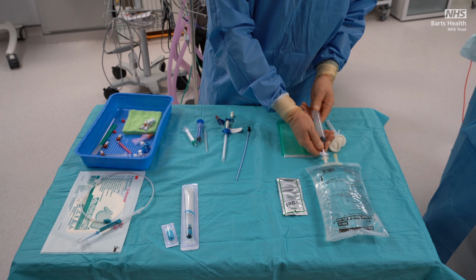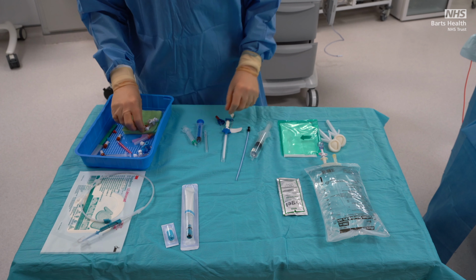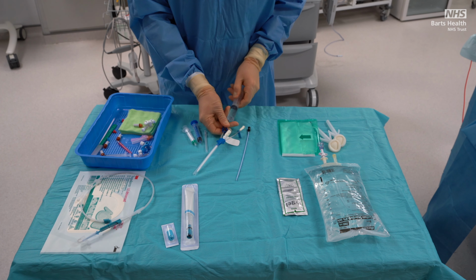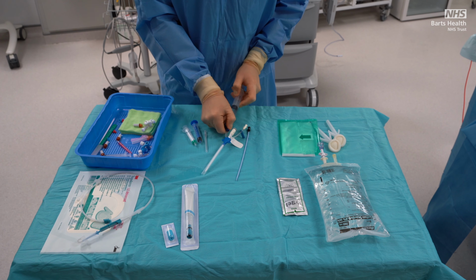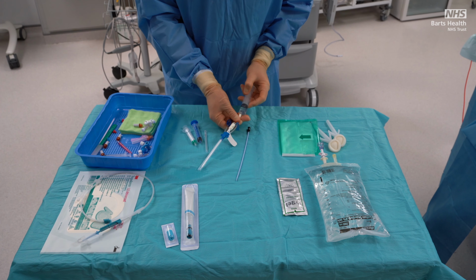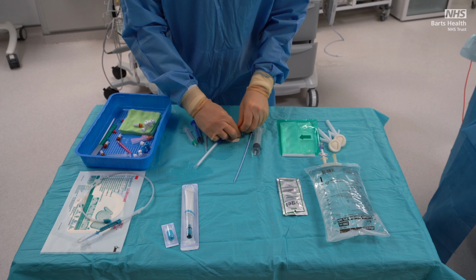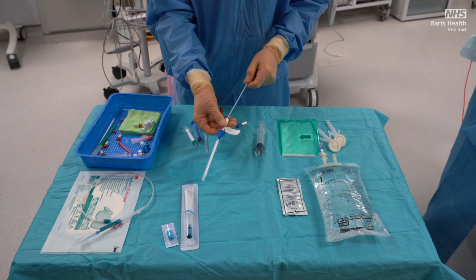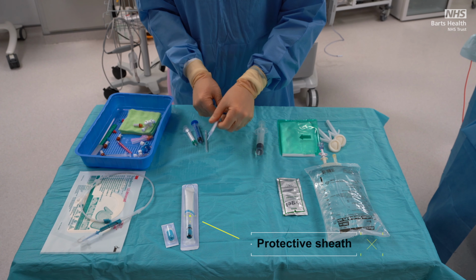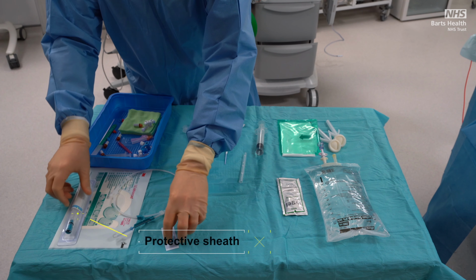The first step is to prepare the catheter insertion sheath for insertion. Ensure sterility is maintained throughout because this line may remain for several days. This will involve priming the lumens and inserting the combined dilator. Please note the sheath comes with a specific plastic cover which is designed to protect the pulmonary artery catheter after insertion. This should be retained.